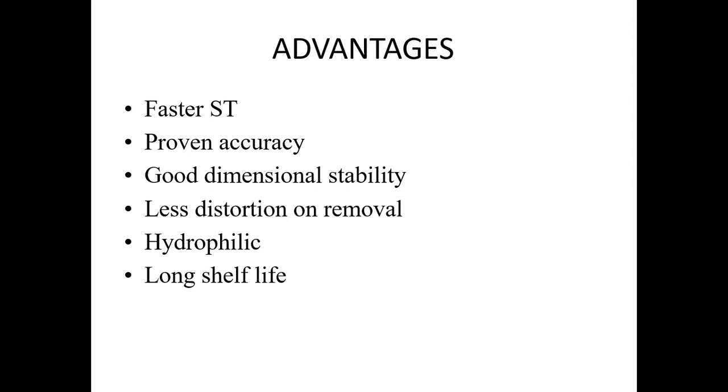Now, coming to the advantages, this material shows a very fast setting time. It has proven to show good accuracy. It has good dimensional stability. The distortion is also very little on removal of the impression. It has a hydrophilic nature, and it also has a good long shelf life.